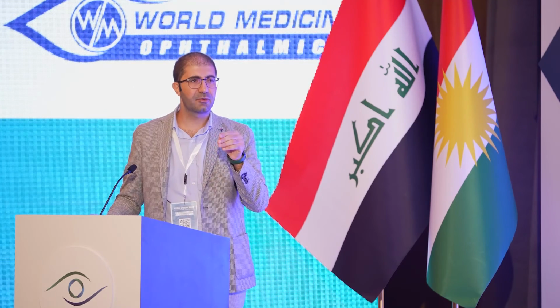Another piece of information, yes, it has been written. There is no problem if you do any injection before surgery; you are imagining that it will help you during the surgery. But there are some bad cases where a suddenly decreased VEGF level can cause crunch syndrome, tightening and shortening the retina. The last case in which I did a retinectomy was one of those examples. It was a 36-year-old poor guy, never treated by anything, and he came to me with about 5% vision. I applied anti-VEGF and didn't examine that patient before surgery, on the day of the surgery. When I got into the eye, it was very late to escape.